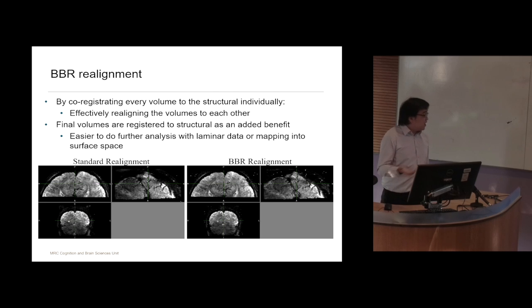An added benefit that I didn't mention is that by doing this entire BBR realignment, your final volumes are already directly registered to the structural. So it's much easier if you want to do further analysis with laminar layers, or if you want to do something like mapping the voxels into surface space.